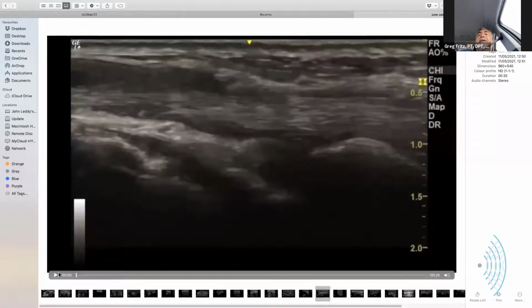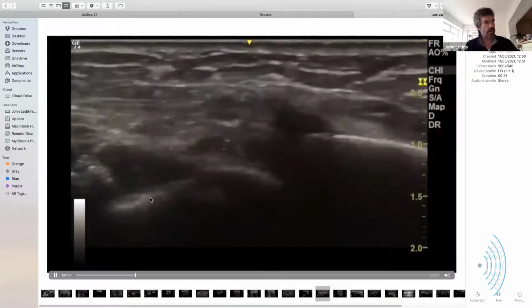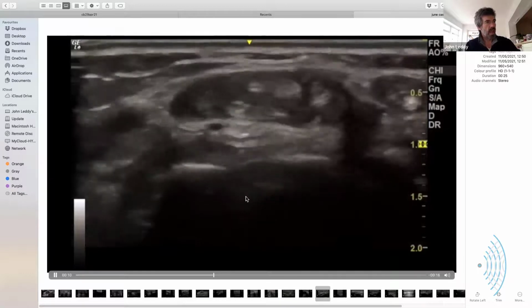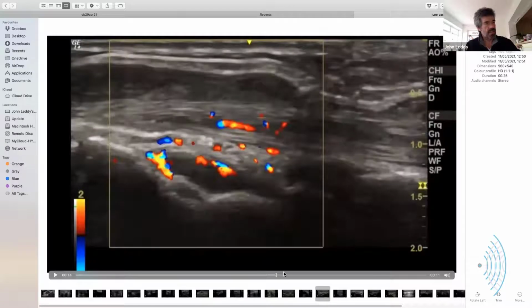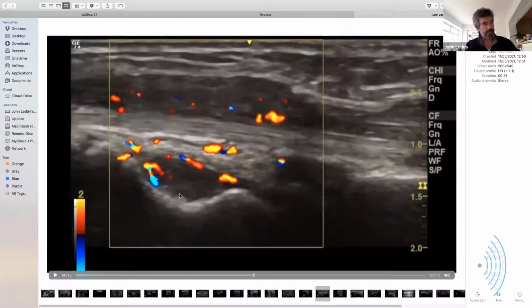So keep going. Now this is a very simple case, but certainly in my practice, I don't see it very often. So I captured a bit. This is the wrist joint, and if I freeze that, this is the recess for the capitate. Okay. And it has that very classic bell-shaped appearance. Yeah. But the synovium from the mid-carpal joint should just run over the bone. And you see how here it's nice and clean, but it's swollen.